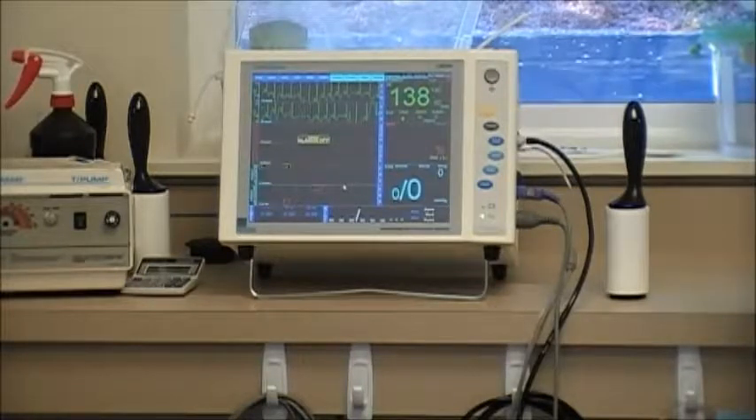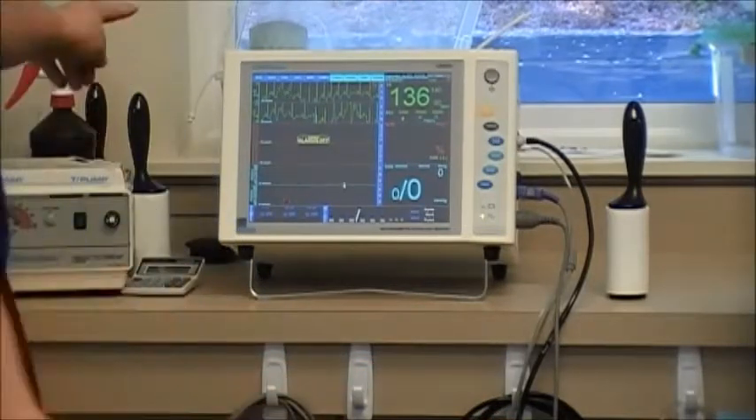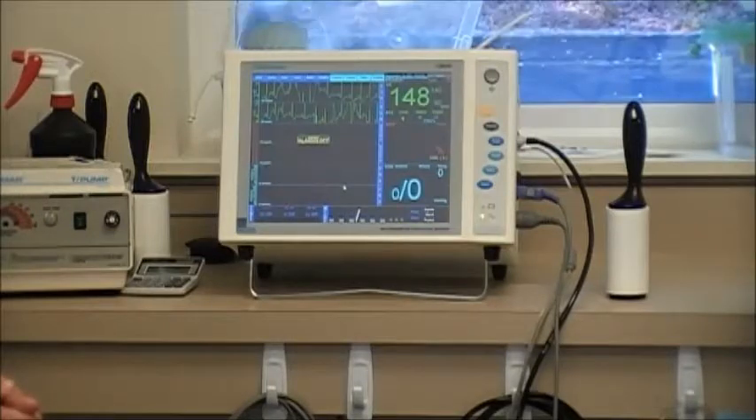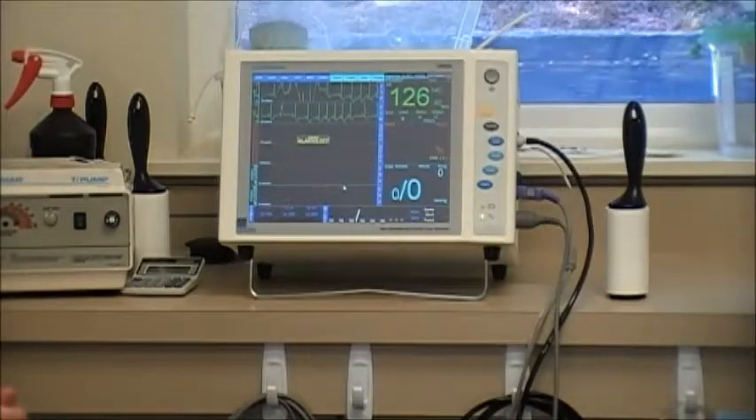You're watching on this EKG for anything abnormal, any sudden jerks. We're getting a few dips right here, but that's because the patient is moving a little bit and not completely still. Now she's holding still and her feet are perpendicular to the body — we're back to a normal rhythm, no abnormal beats in the heart.